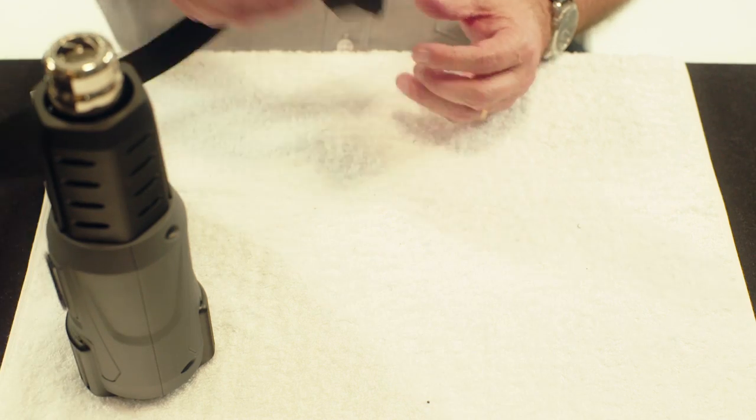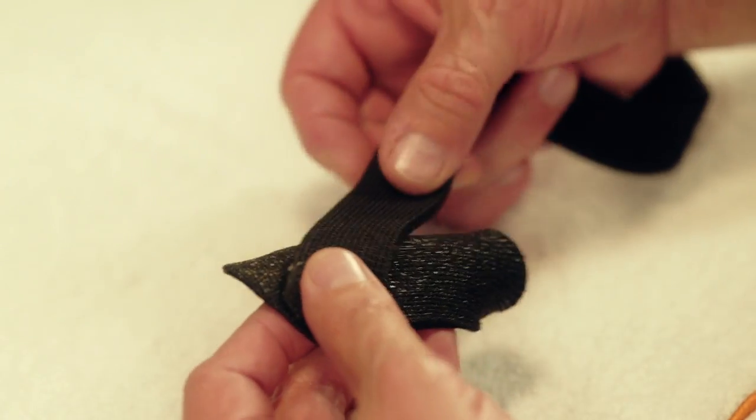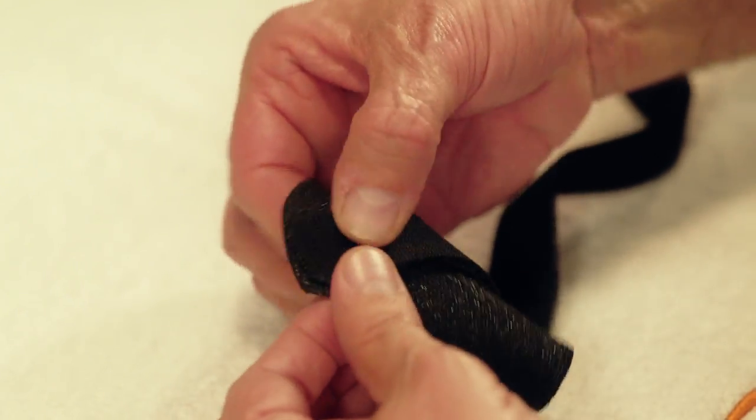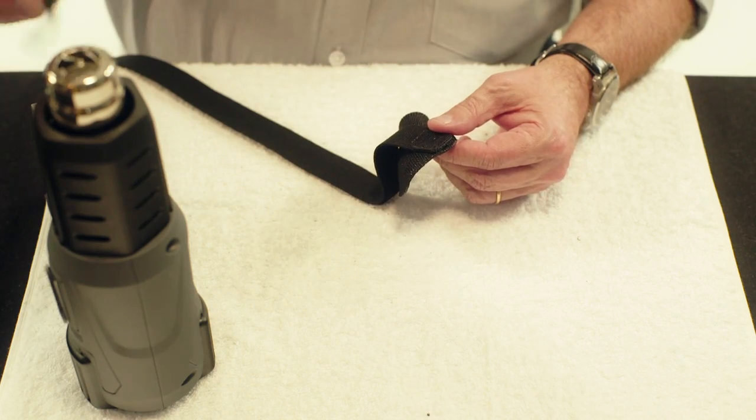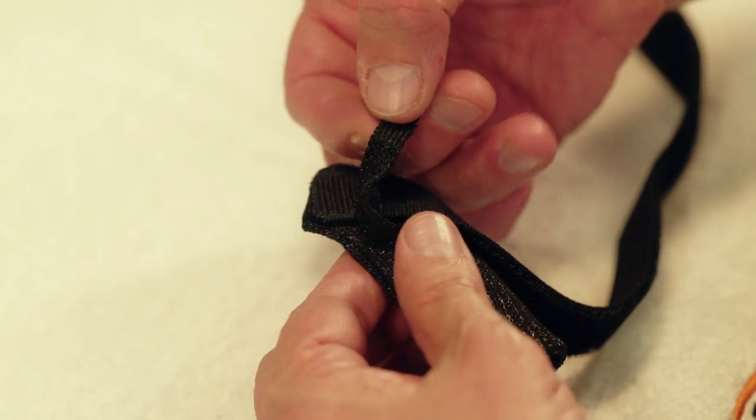Heat the dorsal side of the orthosis with a heat gun and diagonally stick the Velcro loop with the loop side down onto the orthosis. Heat a small piece of Orphicast with the heat gun and secure the Velcro to the orthosis.